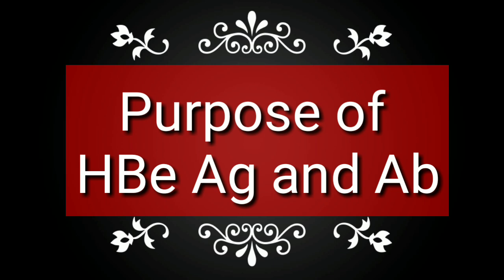So what is the main purpose of HBeAg and HBeAb? The main purpose is to find out whether the treatment that we are providing for the hepatitis B virus is working or not. Another purpose of HBeAg is to find out the chronic and the acute stage of the hepatitis B virus. And the main purpose of HBeAb is to find out the antibody that is developed against the hepatitis B virus infection. So this is a little bit about the purpose of HBeAg and HBeAb.